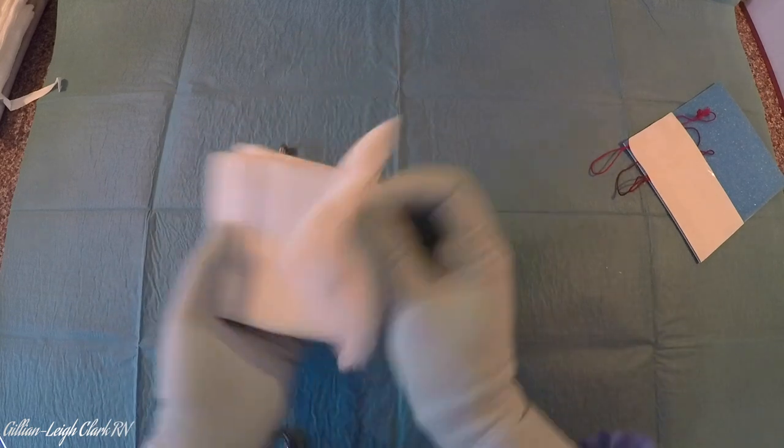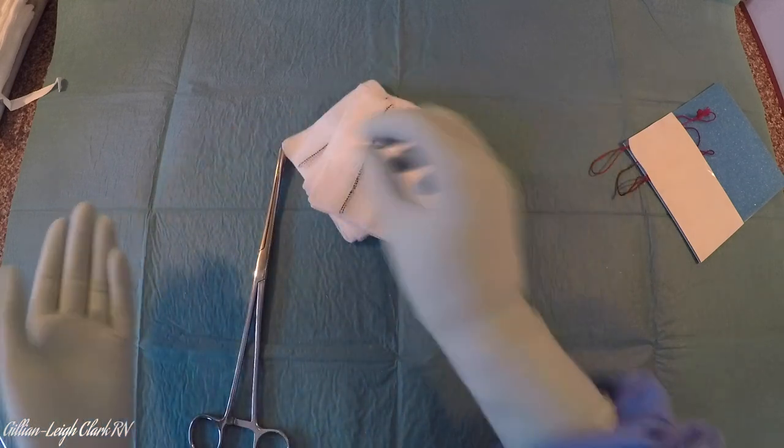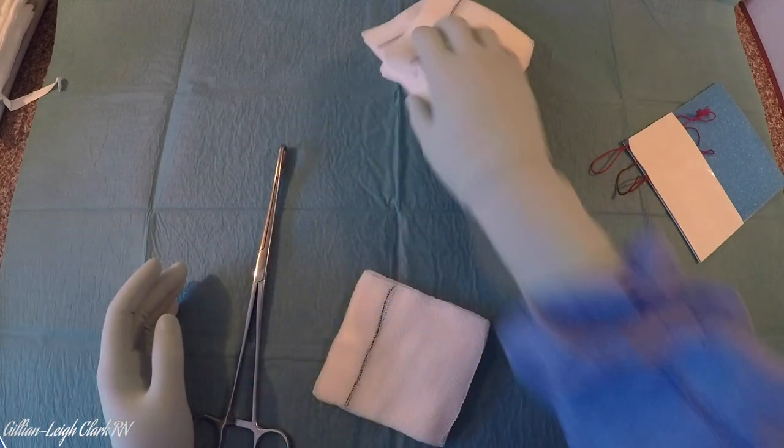I've already counted my five swabs with my floor nurse: one, two, three, four, five. And then I'm going to take one of my swabs and put it on a stick.